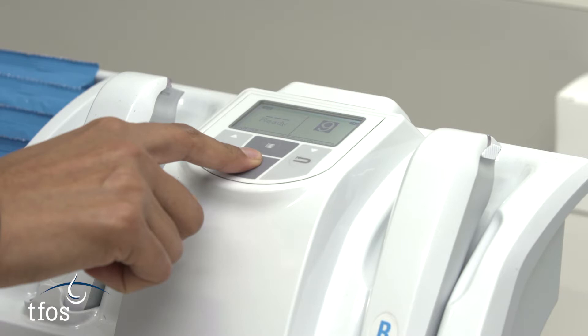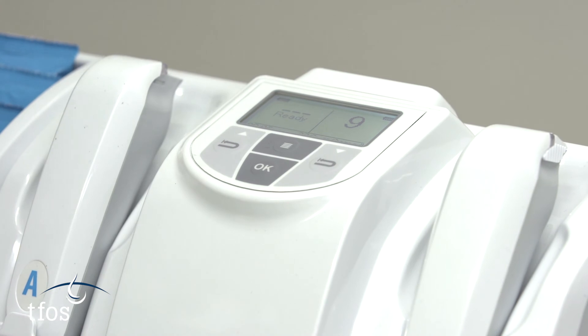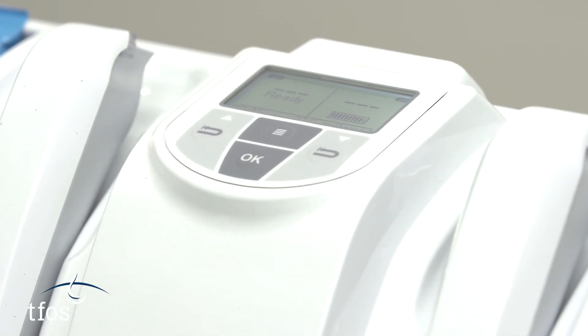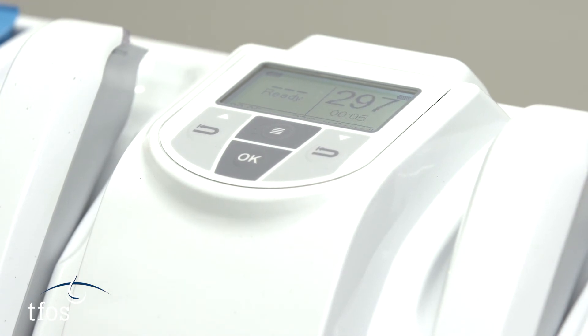As soon as the pen with the tear-filled test card is placed back in the cradle, there will be an option for 8 seconds to alter the number on the device to match that of the test card. Press the arrows to scroll through the options and select the matching number. The device will then automatically proceed to calculate the osmolarity and will display the reading in milliosmoles per litre within approximately 10 seconds.